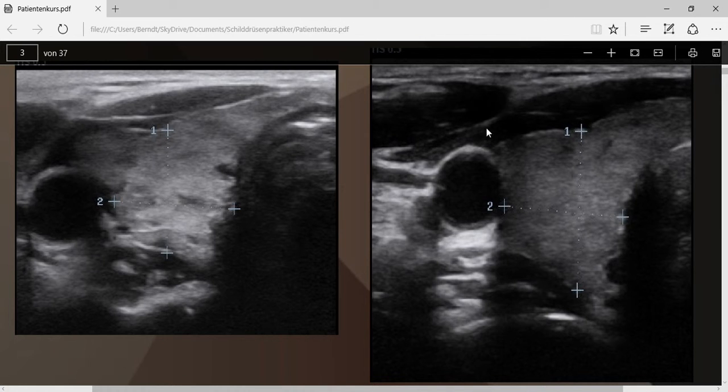In the ultrasound image, you even have those fiber structures that are normal to muscles, whereas here you wouldn't even be able to say if this is a muscle tissue or something else. So you can tell that an acute inflammation of the thyroid affects the surrounding tissues and changes them and contracts them, and you have a lot of scarring, which is actually visible when you look at the patient from the outside.